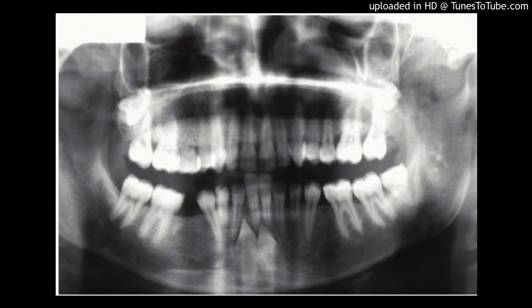Clinical relevance. Treatment often entails the surgical removal of the canine, especially in cases of transmigration. The findings emphasize the importance of early diagnosis and CT/CBCT imaging for further diagnostics and future research of impacted mandibular canines.